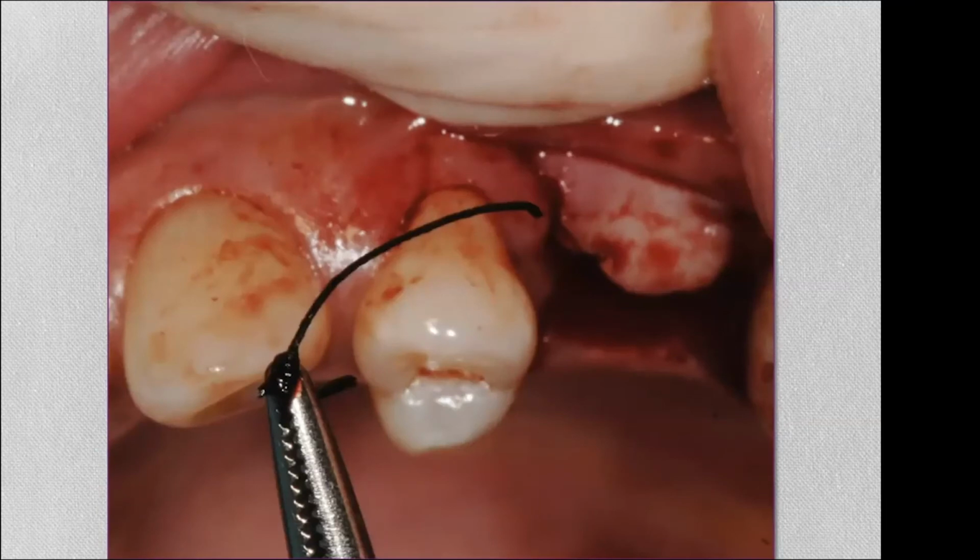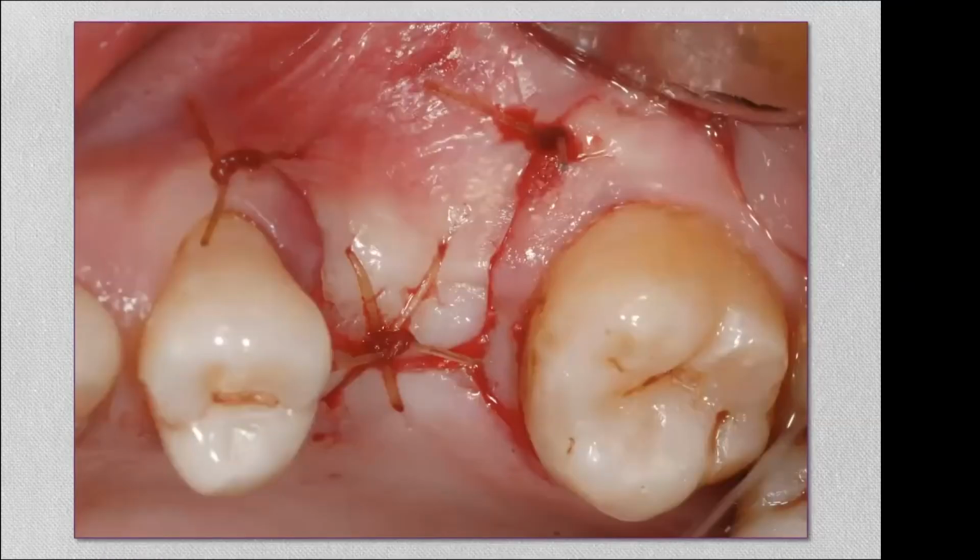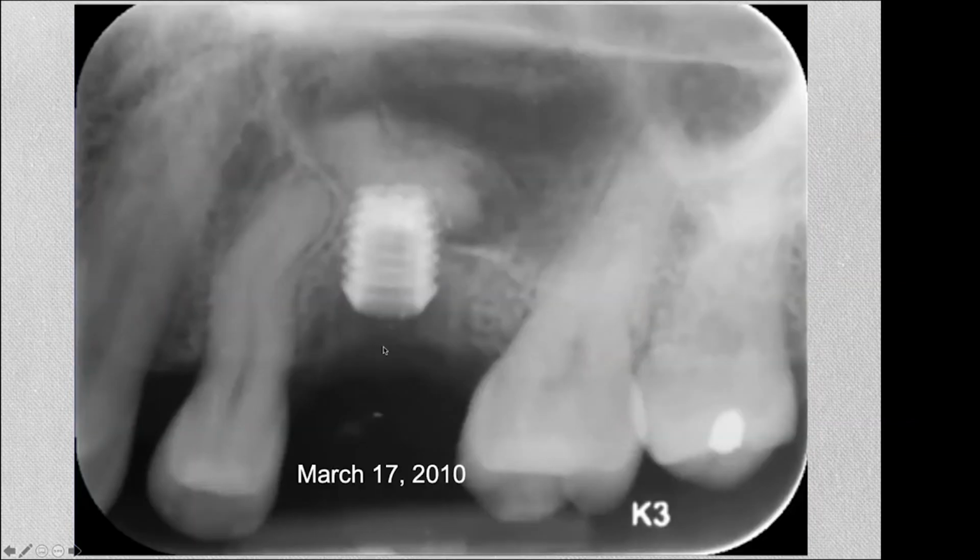And then a quick figure of 8 suture. That's, by the way, the removal of the retention suture. And we use resorbable chromic sutures, and this is a figure of 8 and 2 interrupted sutures. So if you remember what I told you, we went slightly more mesial.